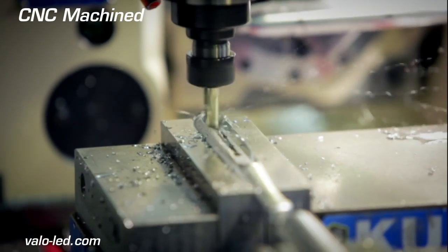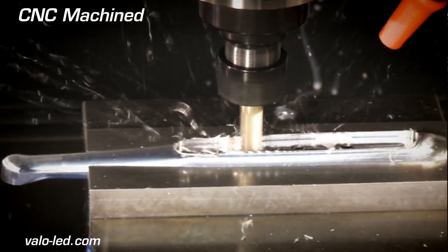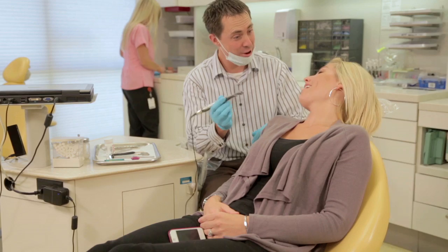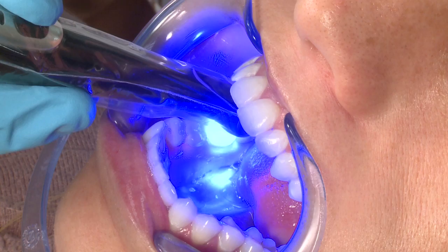This device has been designed, created, put together with precision, with thoughtfulness, with the ultimate benefit going to the patient, but with the trustworthy and progressiveness that dentists know Ultradent to stand for.